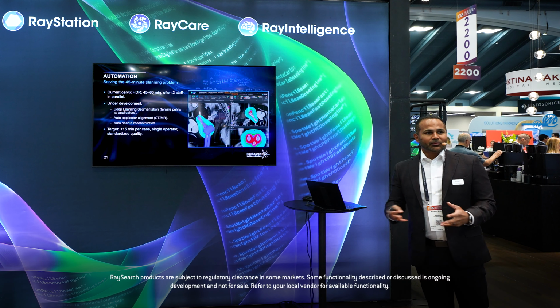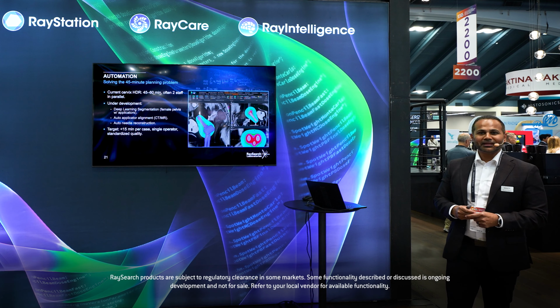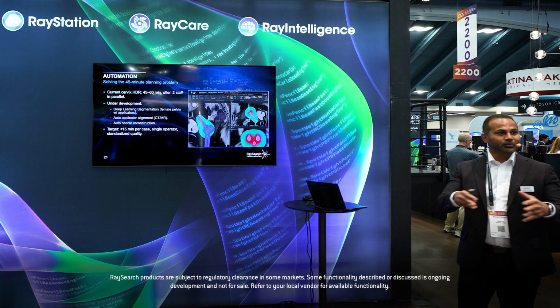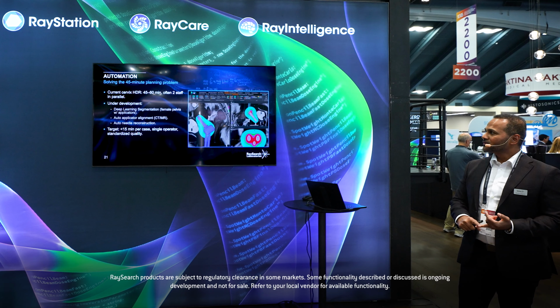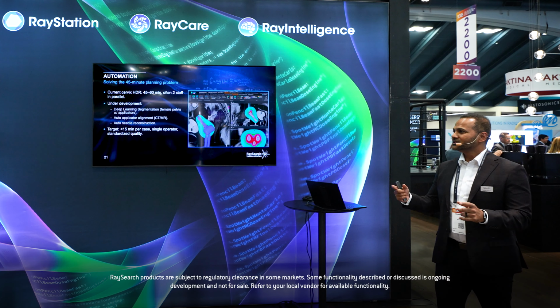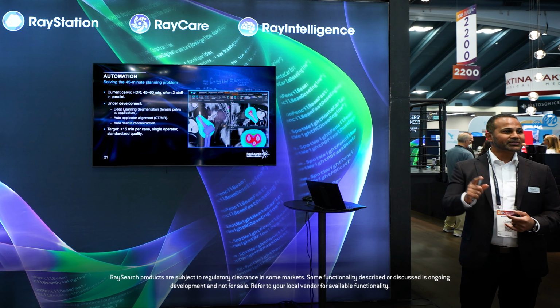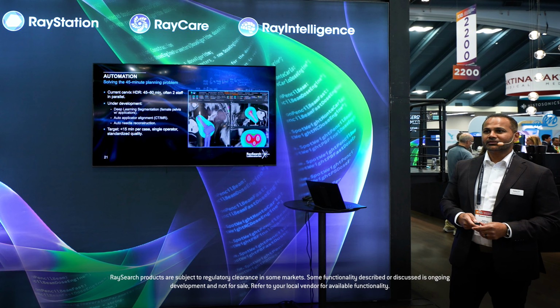So automation, again, is one of the key features of RayStation. We're solving that 45-minute planning problem. The current workflow takes about 45 to 60 minutes, often with two staff working in parallel. What we currently have under development is deep learning segmentation for the pelvis with the applicators, auto applicator alignment with CT and MR, and then auto needle reconstruction. So what we're talking about is bringing that 45 minutes down to 15 minutes per case with a single operator. Great to bring those standardizations into the work here.